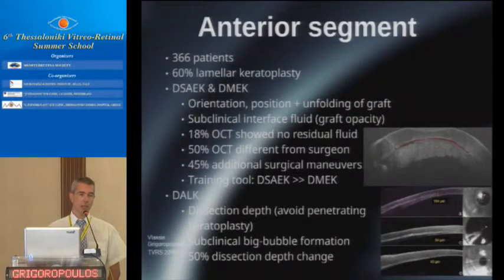So in 1 in 2 cases, the surgeon had to do additional maneuvers in theater to improve his surgery. So the OCT was quite helpful in half of the cases. And also they saw something else different, which was very, very good. It was that the intraoperative OCT was very useful as a training tool.